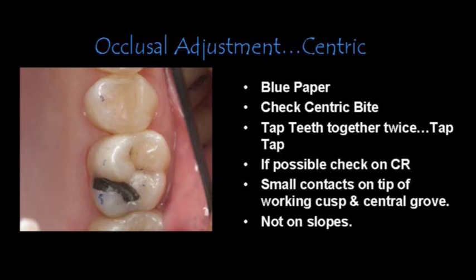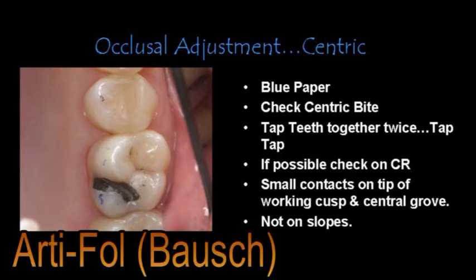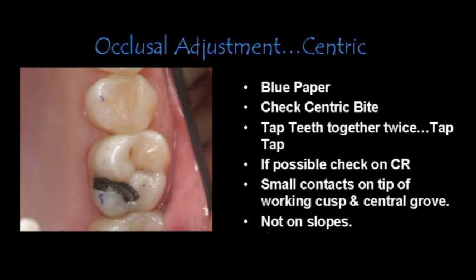I like to use two papers, blue for centric stop, red for lateral movements. I like to use a very thin 40 micron articulating paper, and the teeth have to be dry. The instructions are important. We don't want to tell the patient to close or chew. We want to give our patients clear instructions. Please tap your teeth together twice. That way we will get the centric stops when they tap their teeth together.